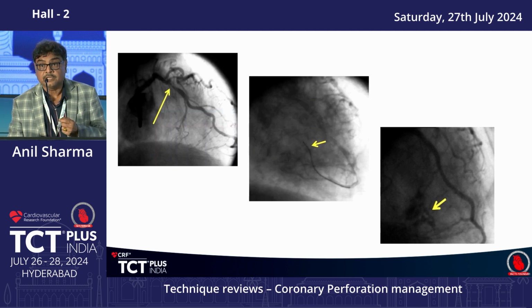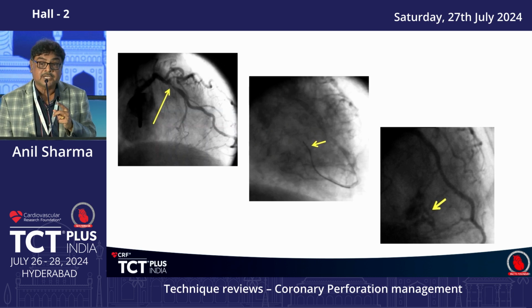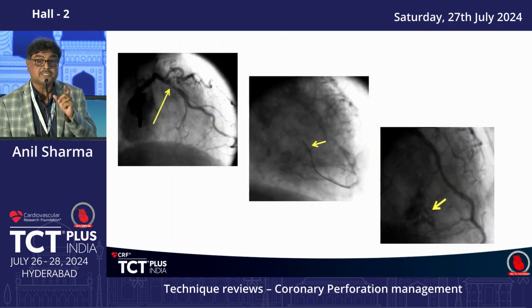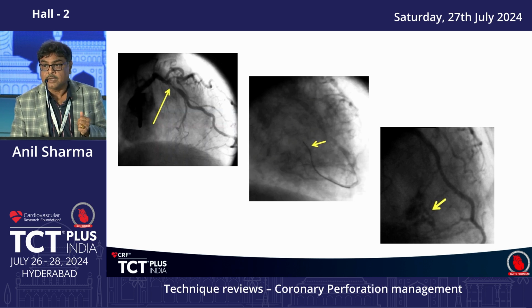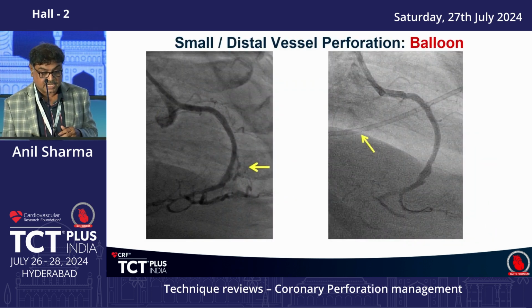So the good technician, not doctor, good technician, when the operator is concentrating on the lesion, should keep the guide and the distal tip in one frame. That is the job of the technician. And the assistant's job is to see the distal tip of the wire. That's why I always say, I don't do this. I have not done. We have done. We. I is मैं. Who does मैं? Ma. And then finish. So this is a branch, RV branch.